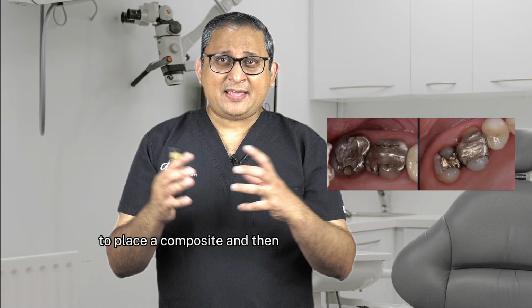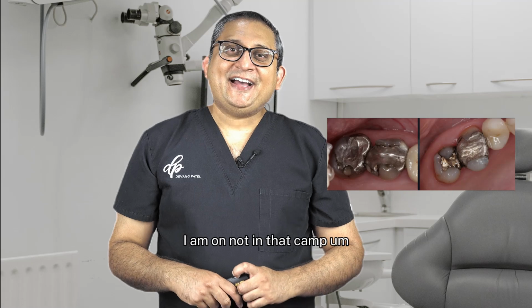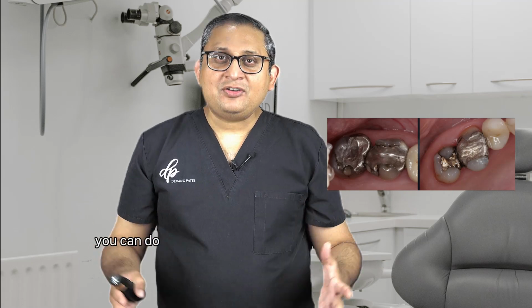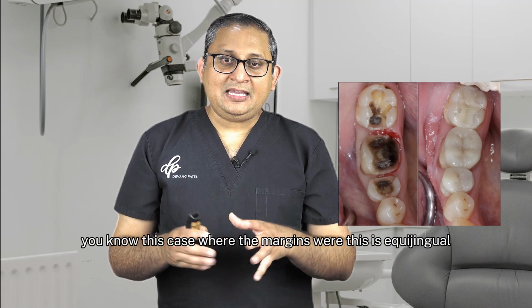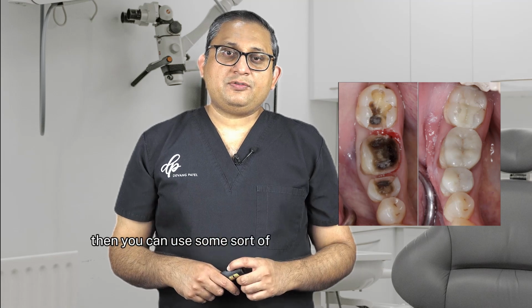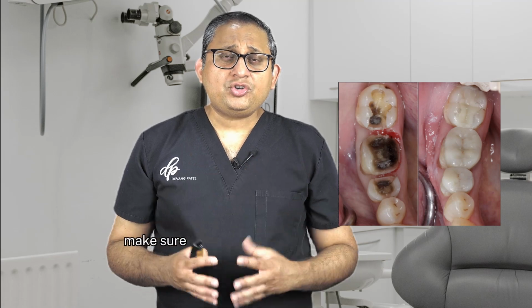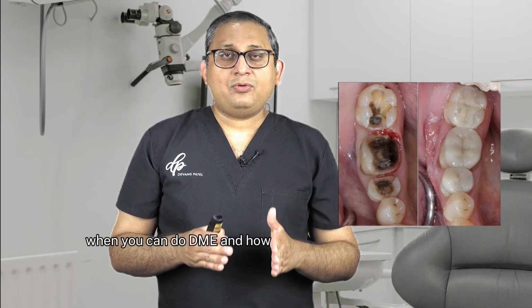When you remove it, you have some amount of tooth to place a composite and then do an indirect restoration. Or if you want direct, because I know many people prefer even direct composite crowns, I am not in that camp. So I do indirect onlays, but you can do whatever you wish by doing DME in these cases. And similar to here, this case where the margin was equigingival, but once you remove the caries, it becomes a little bit deeper, then you can use some sort of matrix system in order to do DME in this case.